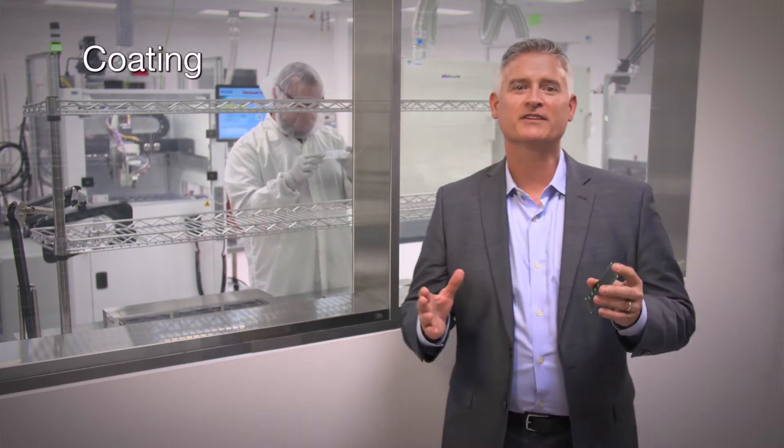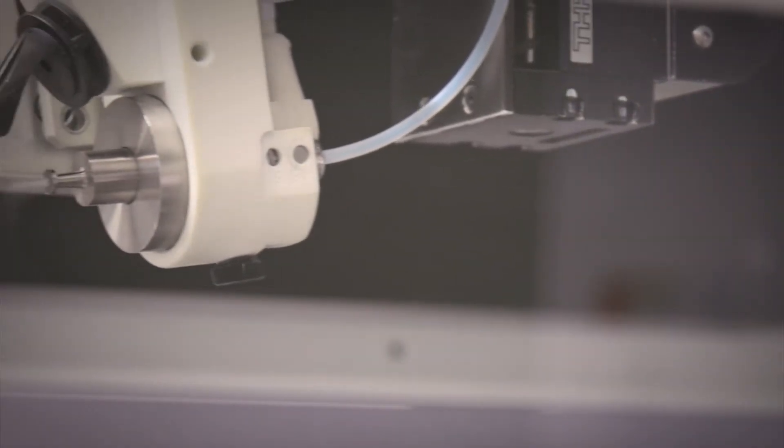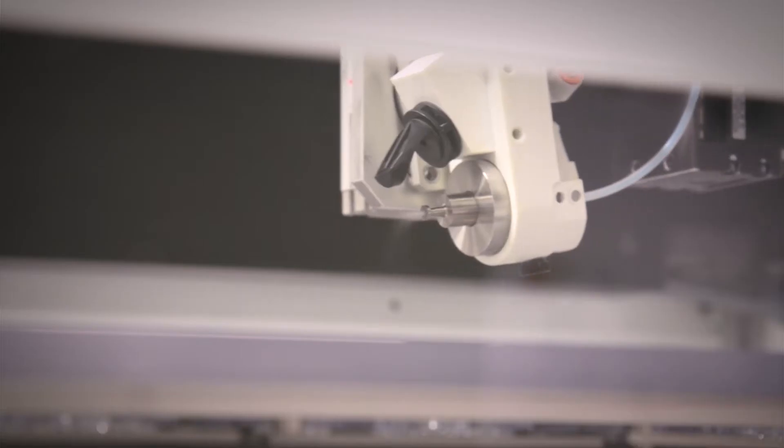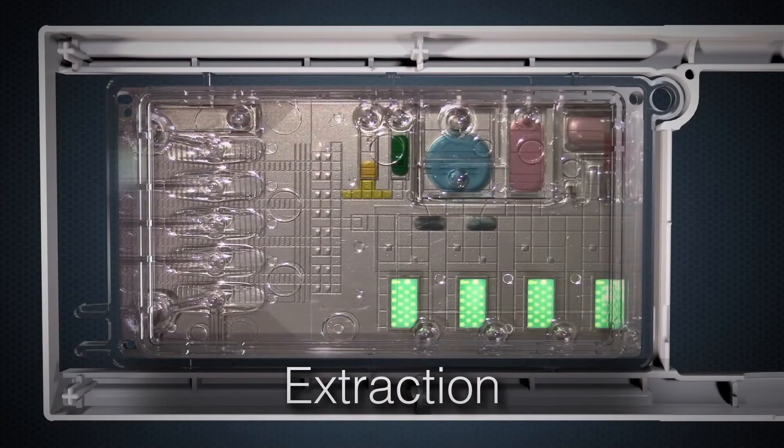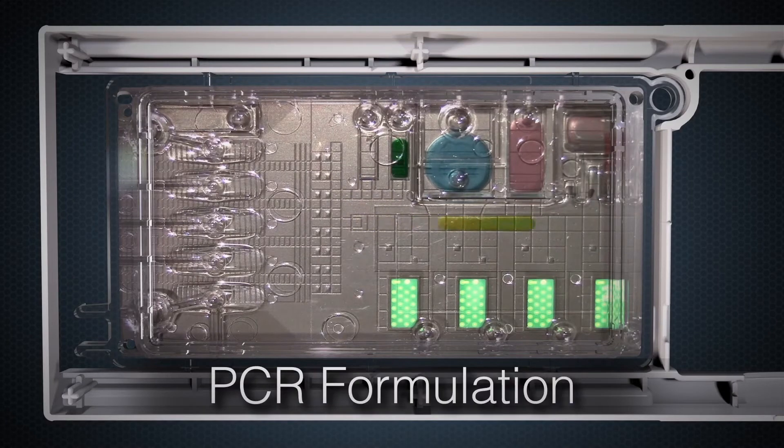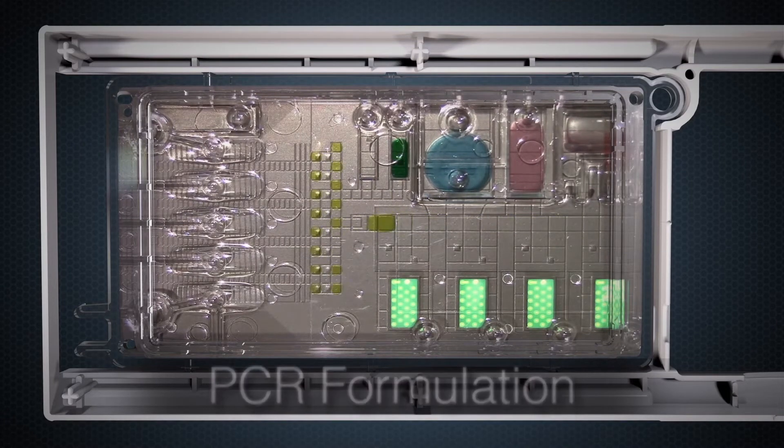Now we'll briefly discuss our coating process which prepares the surfaces of the cartridge. As you can see, we have equipment used to coat ePlex cartridge components. This coating process is required to enable the proprietary microfluidic technology called electrowetting. Electrowetting can be thought of as digital microfluidics where programmed electrical voltages are used to control small volumes of fluid on a specially designed circuit board.